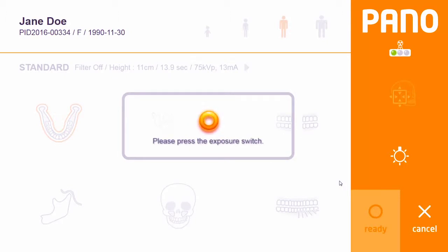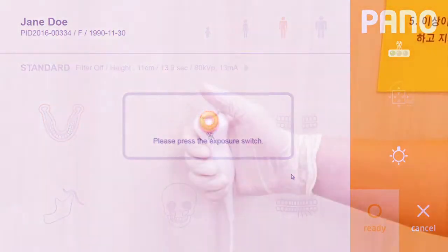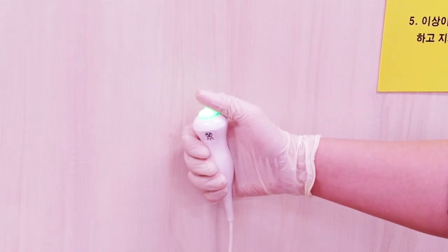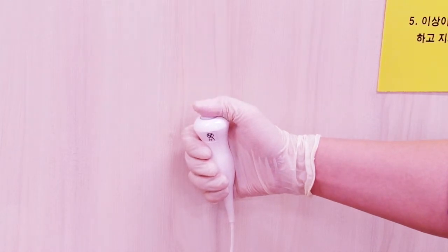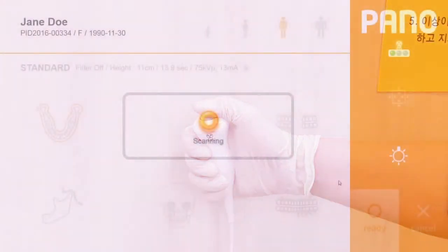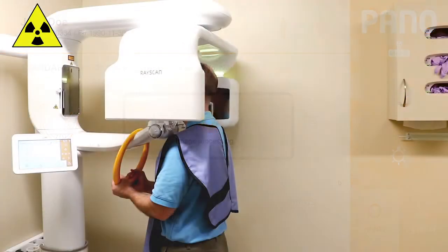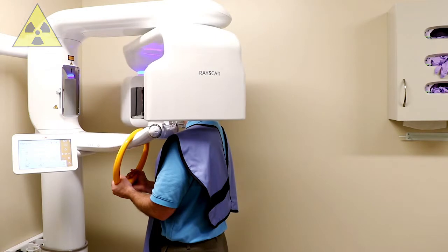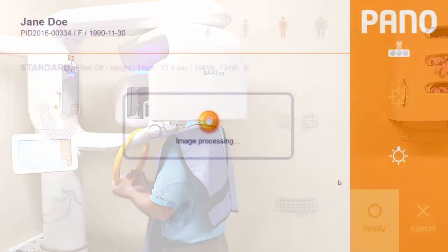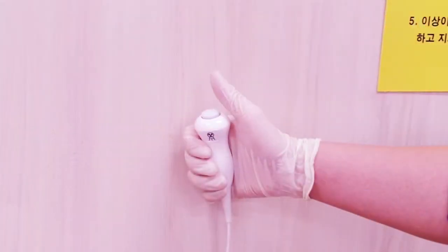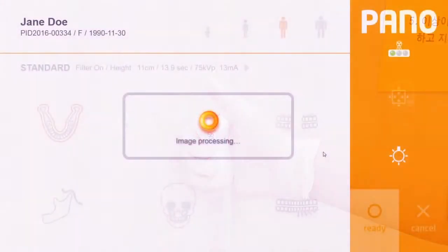Press and hold the exposure switch as instructed in the scanner program. Press and hold the exposure switch for the entire exposure time. Release the exposure switch when the rotation ends.